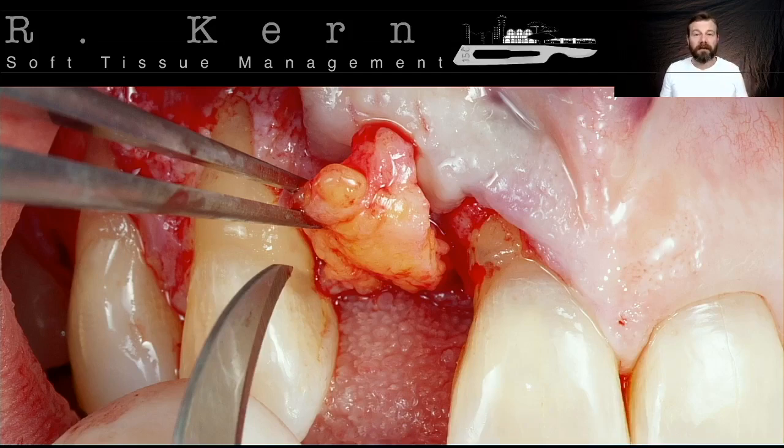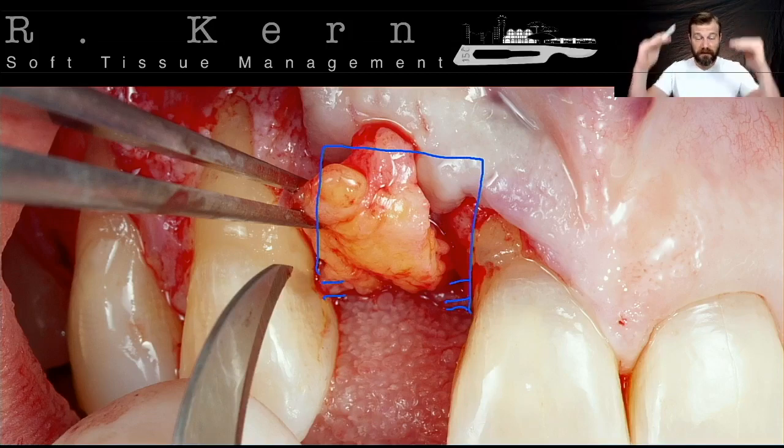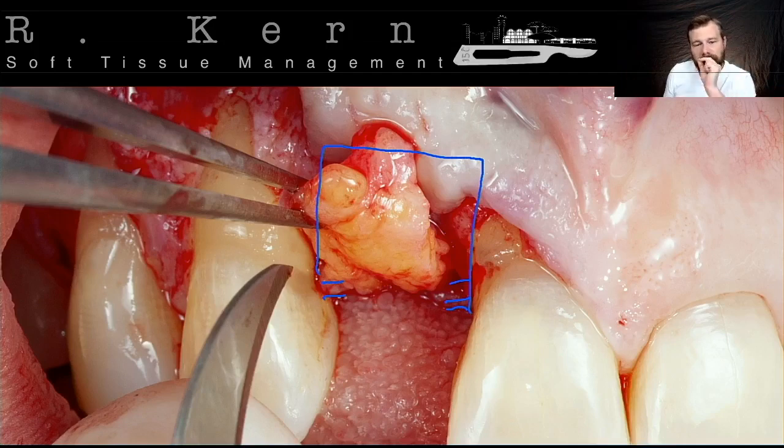What is the shape of the tissue when we graft this area? Usually we think in a square shape connective tissue graft, or a square shape ending of the pediculum, right? Exactly. So you're going to bring the pediculum here, in touch with the papilla, to try to have the papilla back, but there is some area here that you need to think about and be concerned about.